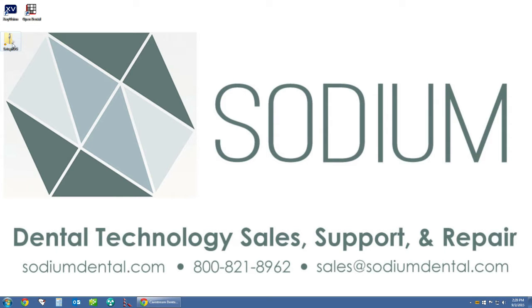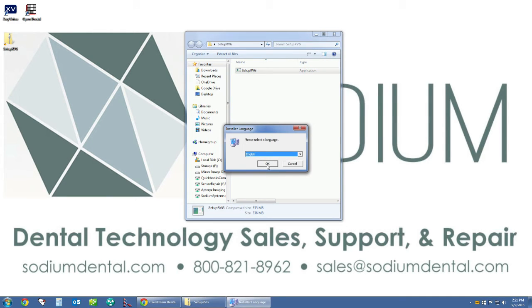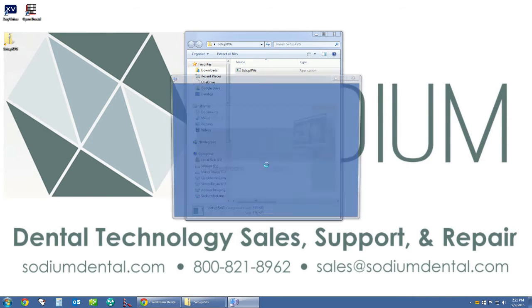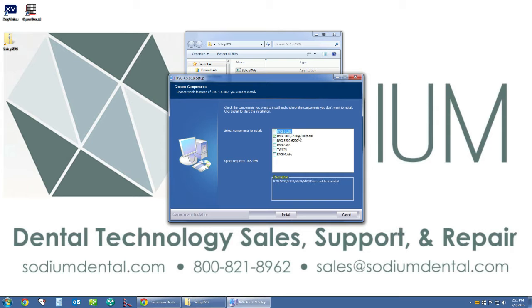Double-click the setup RVG file, and then inside the folder double-click setup RVG once more. This will open up the RVG Twain driver package. Select your language and click OK. Once open, click next and then select the drivers you are interested in. We want the RVG 5000/5100/6100 selected, and we also want the Twain RVG driver to be selected. Then click install.